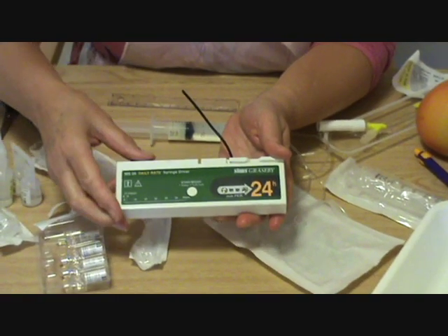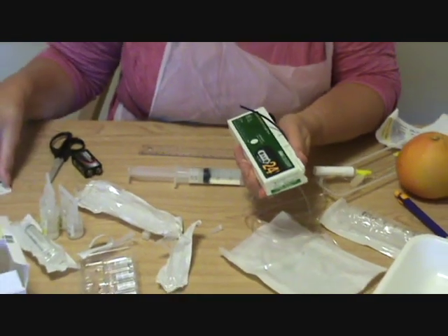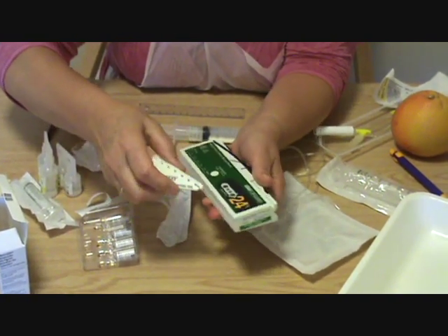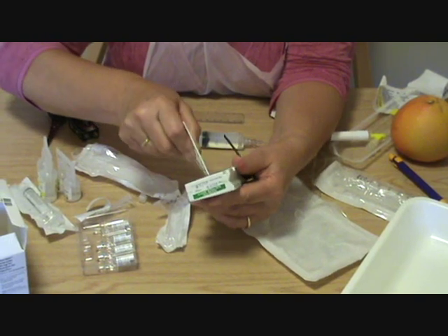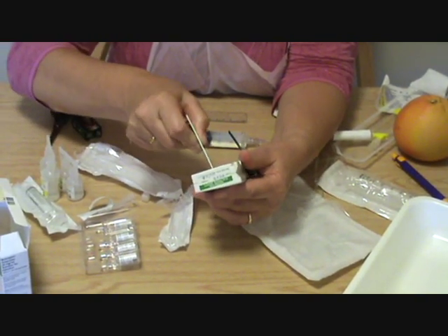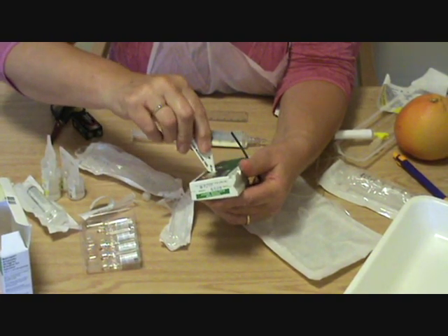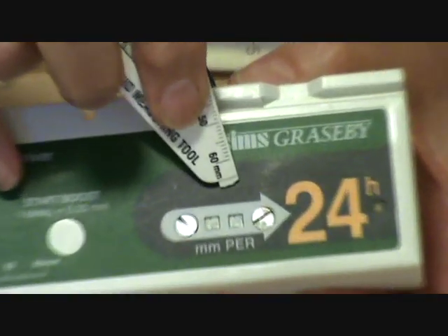I'm just going to go and change that from zero to 50. And to do that, I use the end of this, or you can use a paper clip. Can you see that I've changed that now to five-zero?